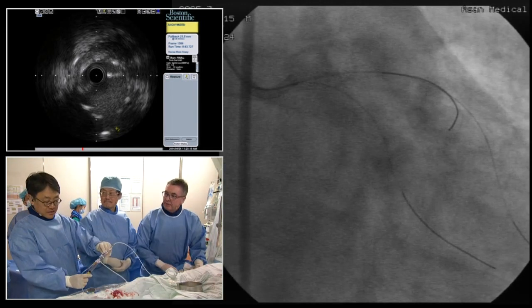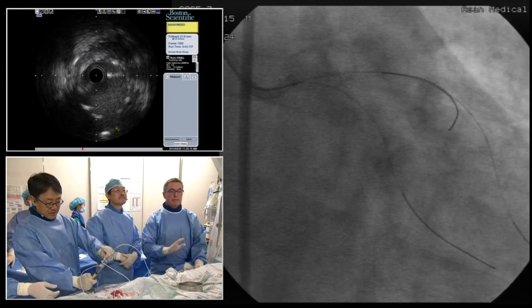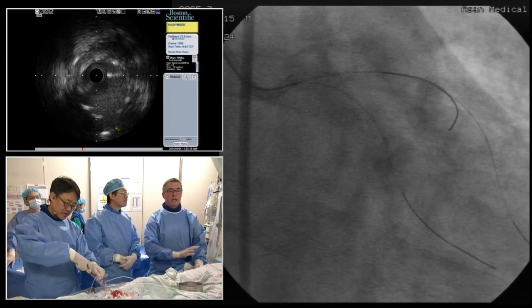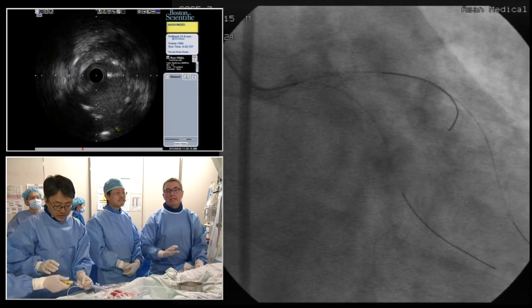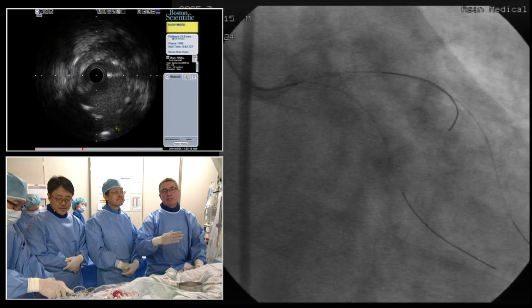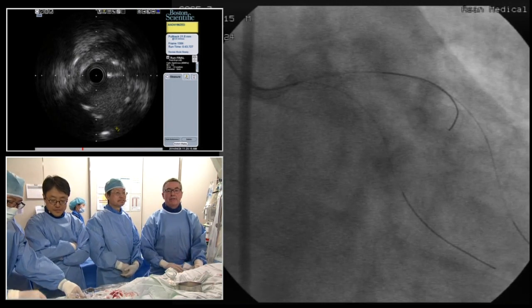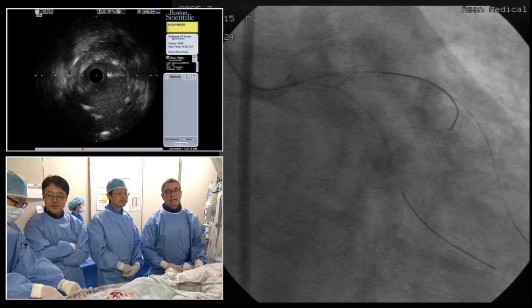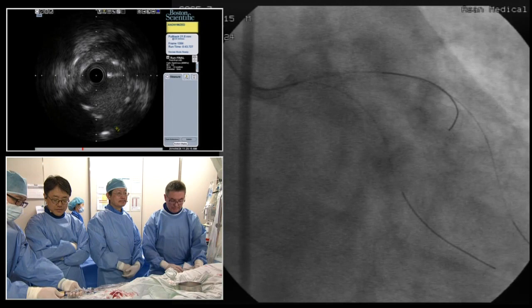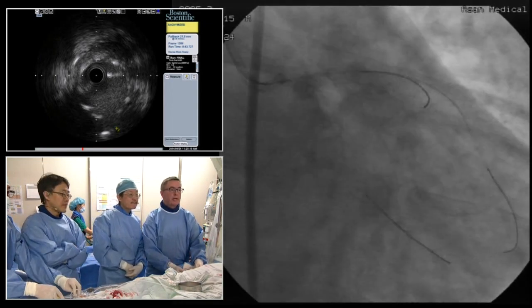Dr. Kang, are you here? Is she here? No. I was going to say if we could see, sometimes it's nice to look at the longitudinal reconstruction image of the diagonal, because when you see that, you can actually see how much of it is actually carina shift by the stent beyond the diagonal, and how much of it is actually osteal disease. And I think that's an important thing to help us. So where are we here? No, that's not going to help at all.